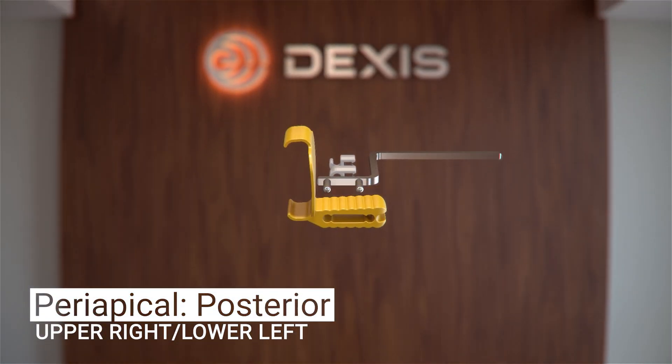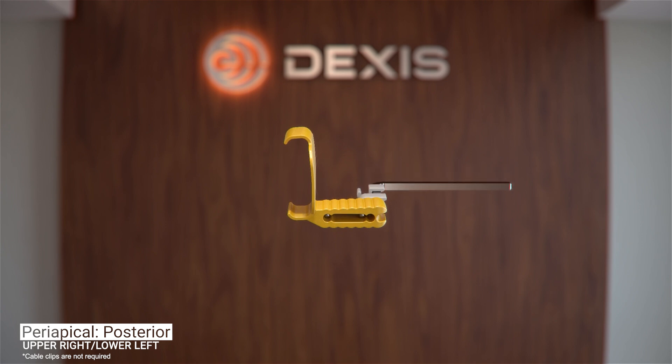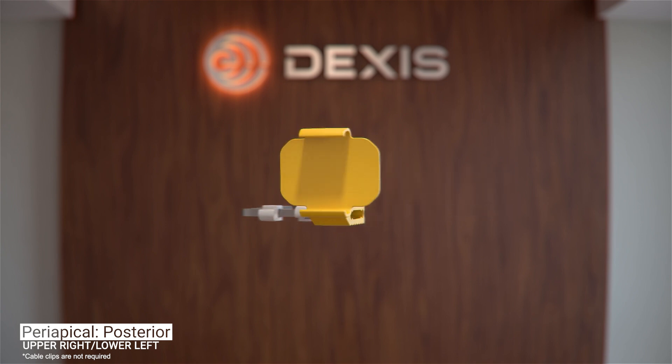The holder setup for this position includes the universal aiming ring, the universal aiming bar, and the yellow posterior periapical bite block.